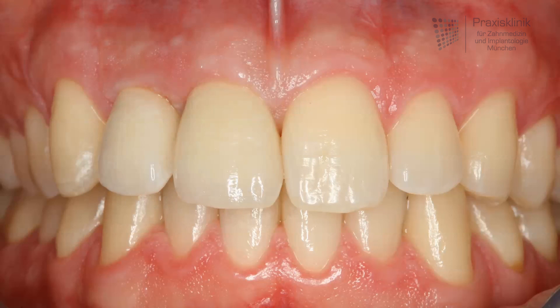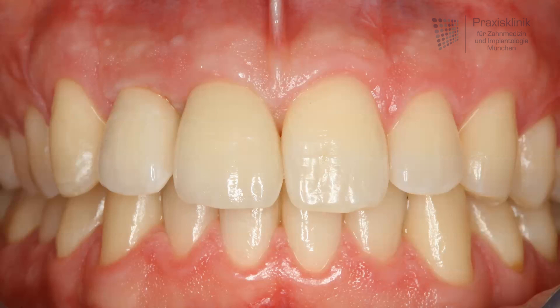The final picture shows the high aesthetic outcome of the implant therapy in this case. Thank you very much for your kind attention.